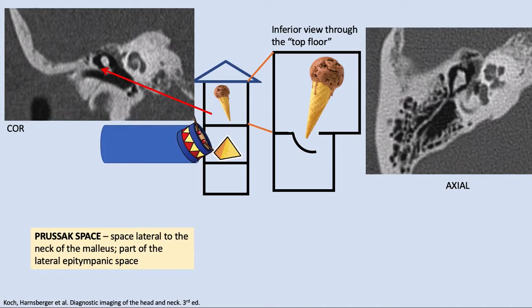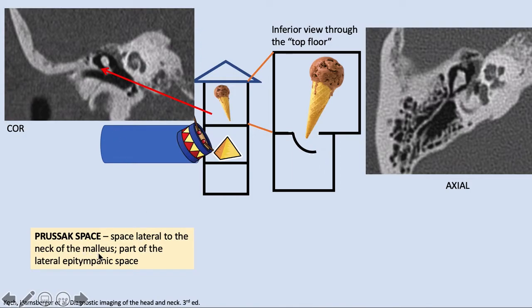Another important space in the epitympanum is the space lateral to the malleus — lateral meaning toward the tympanic membrane. With the tympanic membrane coursing like this, if you have a retraction or unfolding of that portion of the tympanic membrane, you can have formation of a cholesteatoma in that portion, lateral to the neck of the malleus. This space is called the Prussak space, which is part of the lateral epitympanic space.